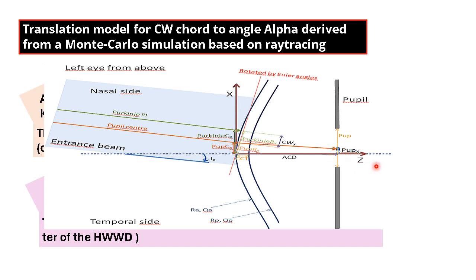However, in reality, as you know, because the macula is located temporally, the eye is a little bit tilted or moved in such a way to pick up these rays. So what he did, he simulated a ray trace and tilted it by a special angle to be coaxial with the visual axis. And these rays project a Purkinje image on the surface of the cornea.